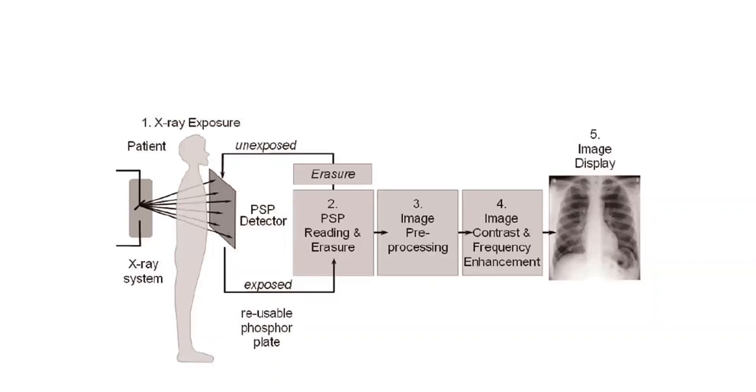So now we have electronic arrays. Like your peripheral brain in your pocket has a more complicated sensor array than the most complicated SLR cameras did when they first came out 20 years ago, and it's packed on this tiny little microchip. And what we can do now is we can actually sense the X-ray photons with a similar high density array and process that information. You can get weighted averages, and you can do post-processing computing, and basically you're weighting pixels.